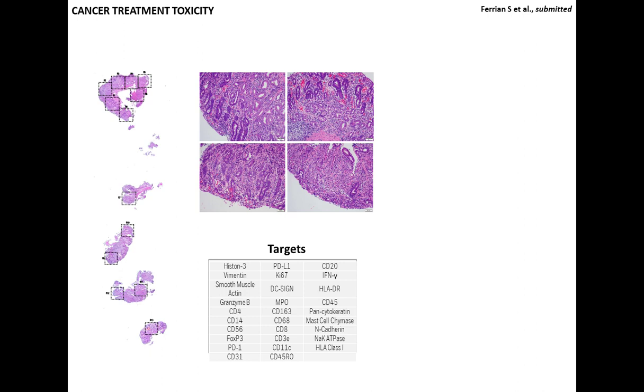On these 4 representative images selected, the biopsies from the gastric antrum and body show similar features, which were characterized by diffusely eroded mucosa with crypt injury and dropout associated with intraepithelial and lamina propria mixed inflammation that included frequent lymphocytes and neutrophils.